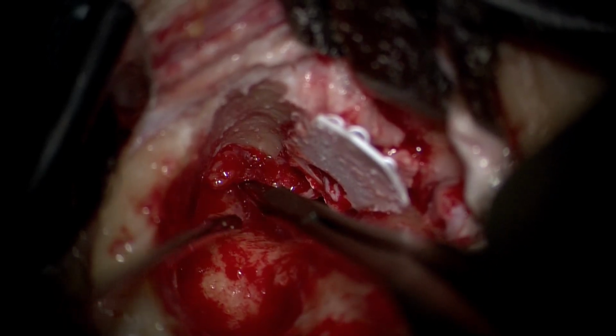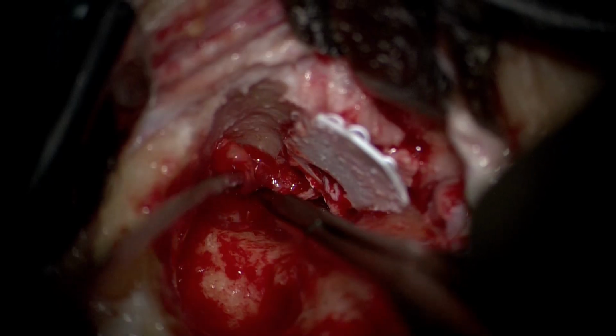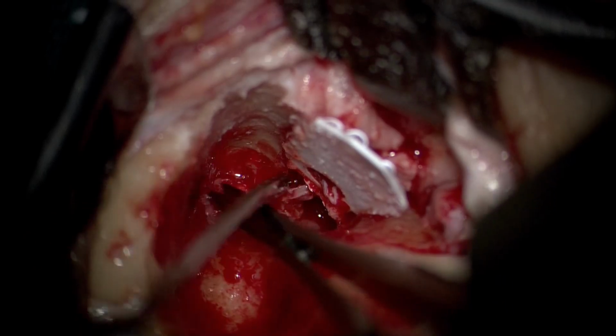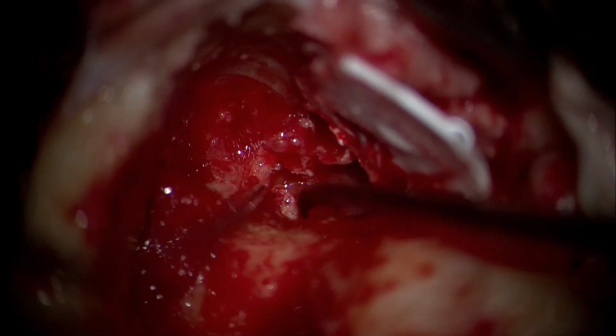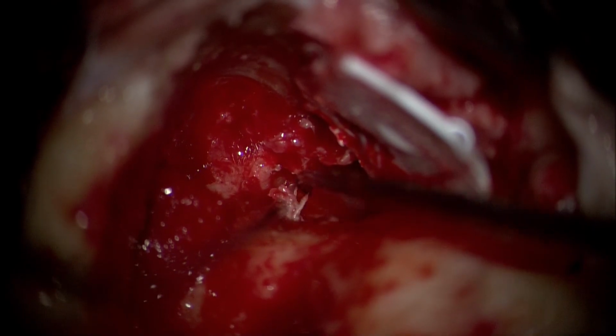So very often it is not too difficult to raise the epithelium over the lateral fistula, especially if it is a very small one. It comes off in one piece like it is in this case. You don't see any epithelium. Whereas most of the time the toughest part is over the stapes, and like such, you can see how the epithelium is engulfing the stapes head.